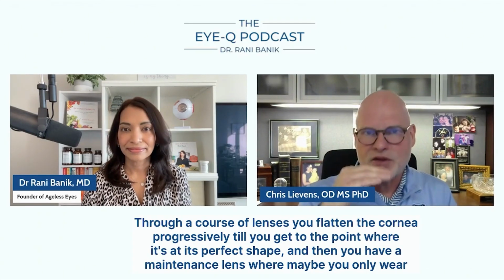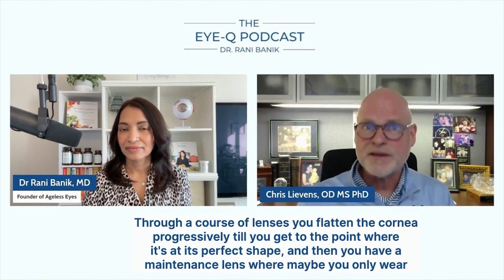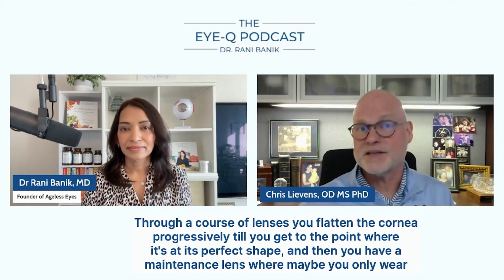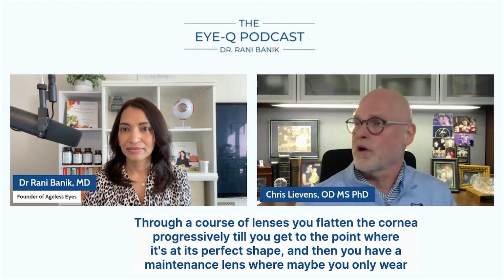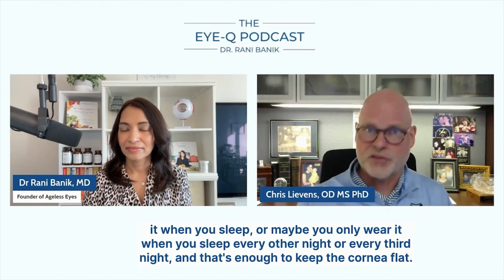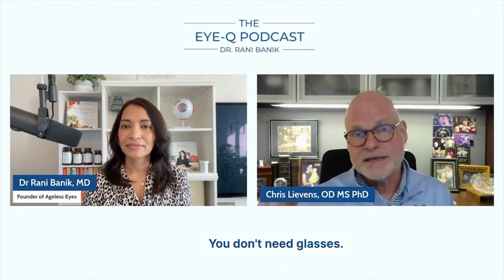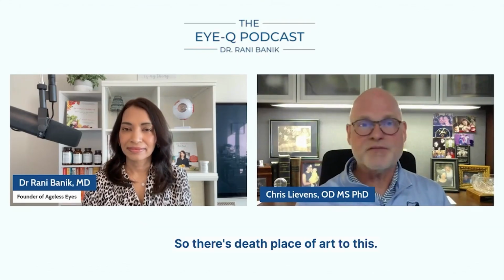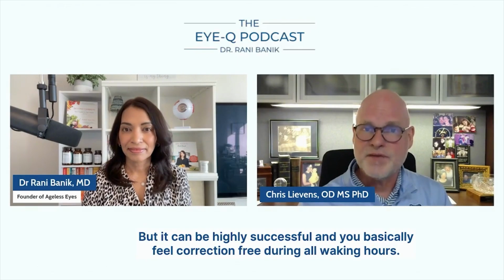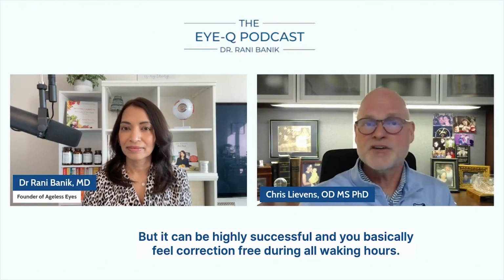You flatten the cornea progressively until you get to the point where it's at its perfect shape, and then you have a maintenance lens, where maybe you only wear it when you sleep, or maybe only every other night or every third night, and that's enough to keep the cornea flat, and you don't need glasses. So there's definitely some art to that, but it can be highly successful, and you basically feel correction-free during all waking hours.